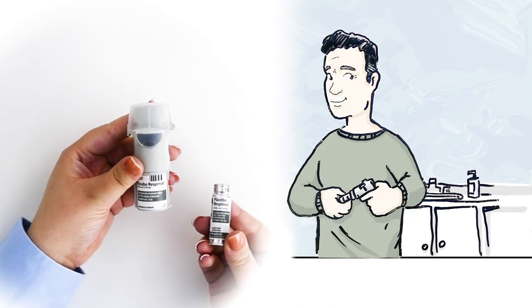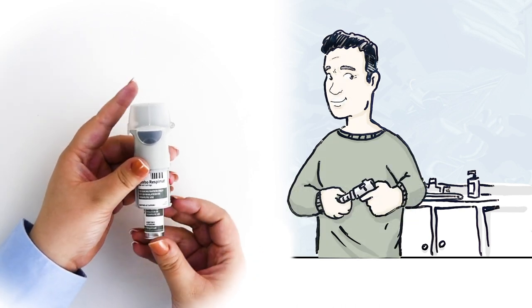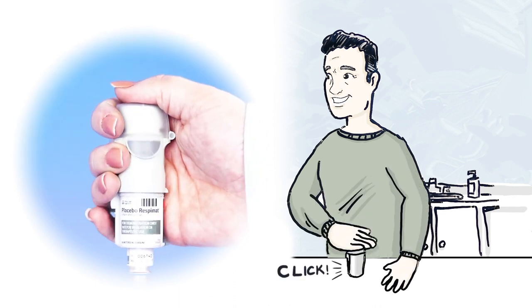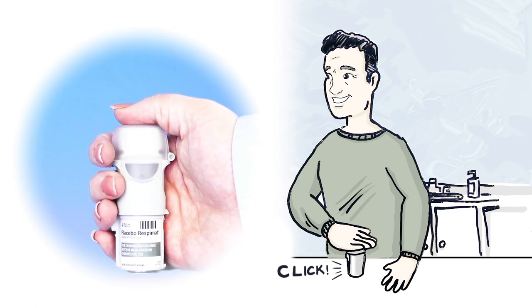To load his medication, Henry inserts the narrow end of the cartridge into the inhaler. Placing the inhaler on a flat surface like a table or counter, Henry pushes down firmly until he hears a click.